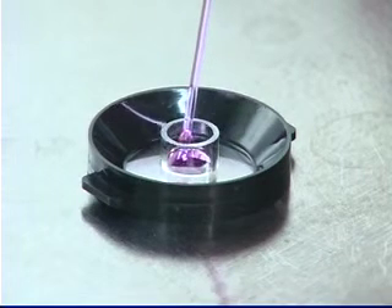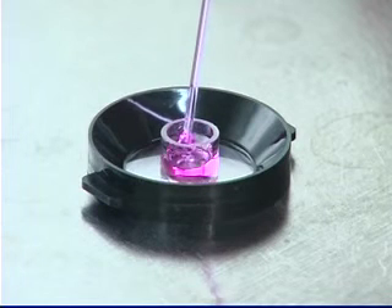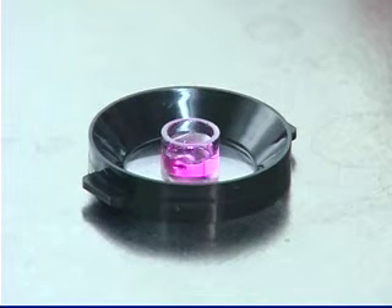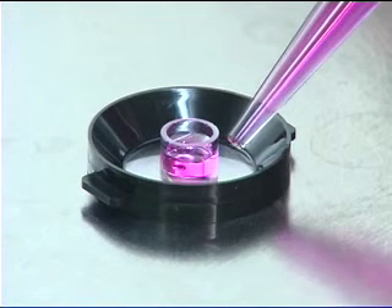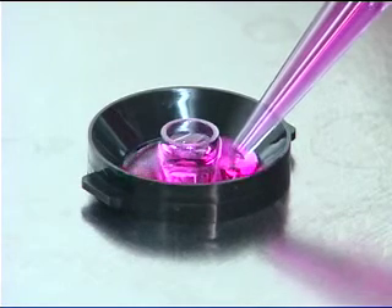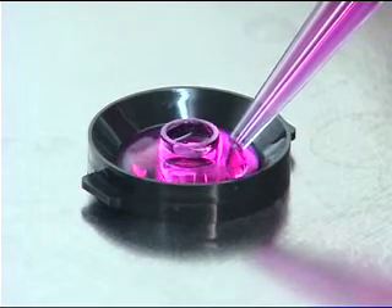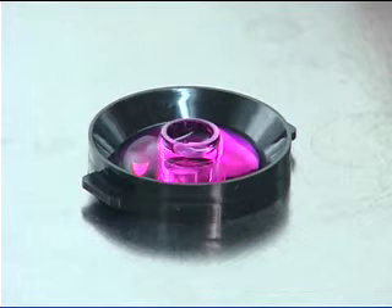It works in the same manner as having two microscope slides stuck together with a drop of water. The optically flat end of the glass culture cylinder forms a hydrostatic bond with the glass coverslip it is resting on, forming a temporary seal onto a flat glass surface without the need for grease. This enables you to position your cells at an optimum location in your dish or coverslip while they plate.